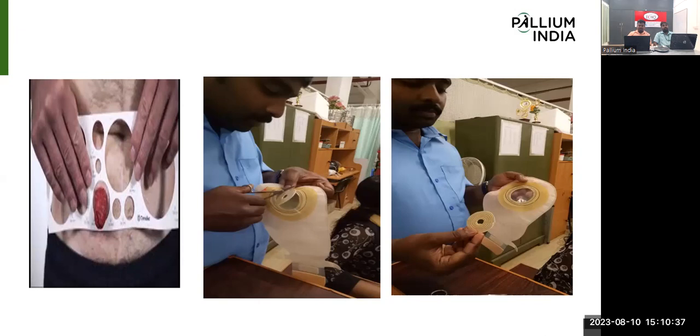One thing we need to keep in mind while preparing the hole according to the size: the hole should never be too tight, because it will disturb the stoma. Too loose, exposing the peristomal area, will cause leaking of the fecal matter or other contents, which will keep in touch with the peristomal area. So the hole will be appropriate by using the measuring gauge. We should select a maximum of 4 millimeter bigger than the actual size of the stoma for cutting the faceplate of the colostomy bag.